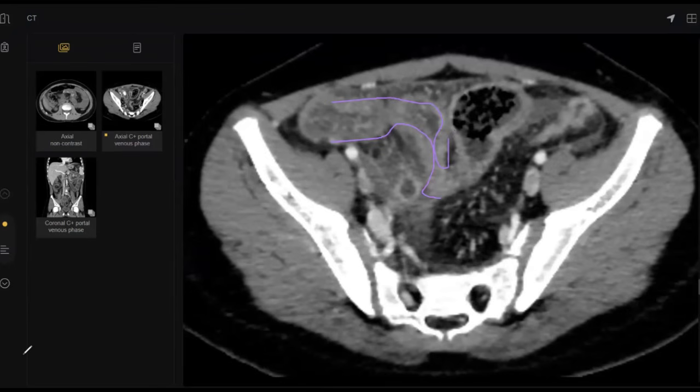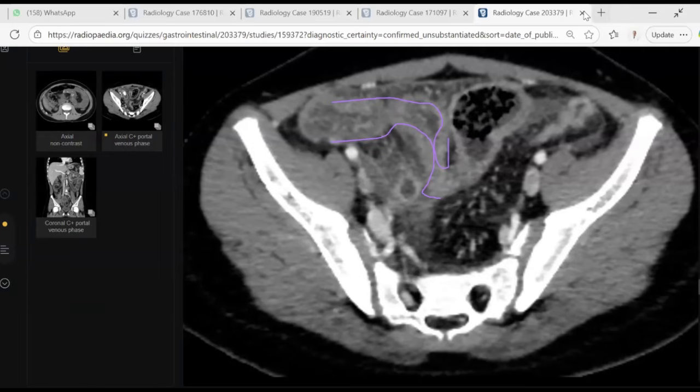Sometimes we don't trust our eyes. Why? Because you may be presented with an unfamiliar case, and we are worried. No, this is not appendicitis. Like also the case before. No, this is not RCC. From now, consider you will be presented with one or two cases with atypical pathology or atypical scenario. So trust your eye. Describe what you are seeing. This is all. Thank you, doctor, so much. Perforated appendicitis complicated with IO and terminal ileitis.